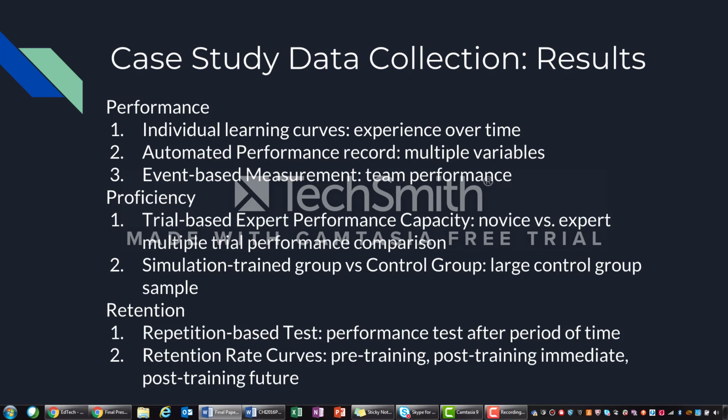In order to understand the level of experience gained over time, we look into the learning curve for performance for each individual. The level of experience here would be a measure of the amount of content or skills learned in operating a device. The validation effort represented by learning curves is not sufficient for understanding the student's complete learning abilities on a simulated tutor.